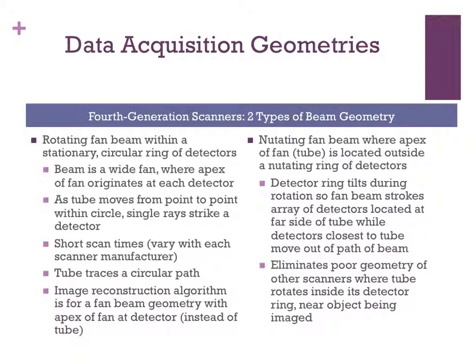The image reconstruction algorithm is for a fan beam geometry in this type of scanner, in which the apex of the fan is now at the detector, as opposed to the X-ray tube in the third generation.